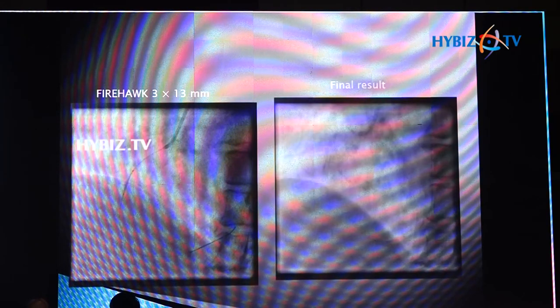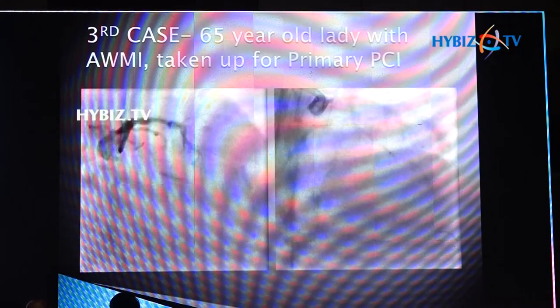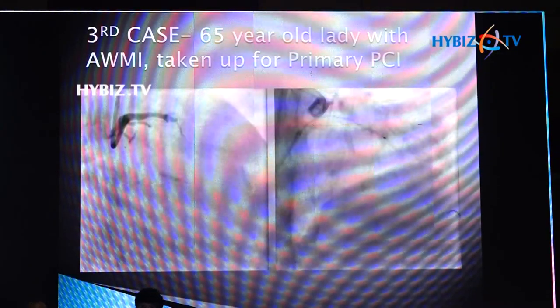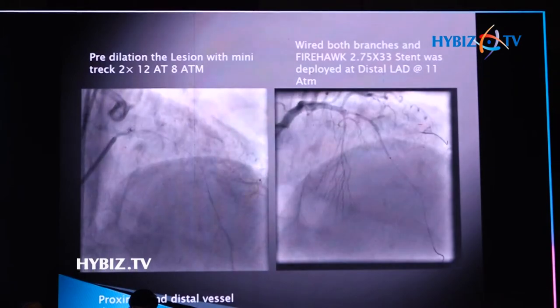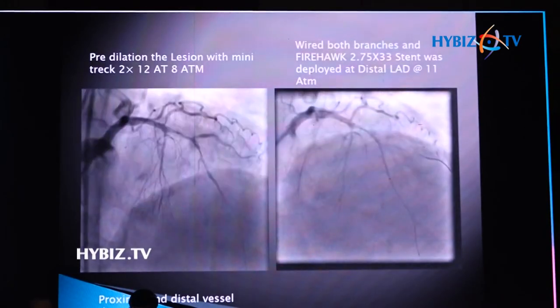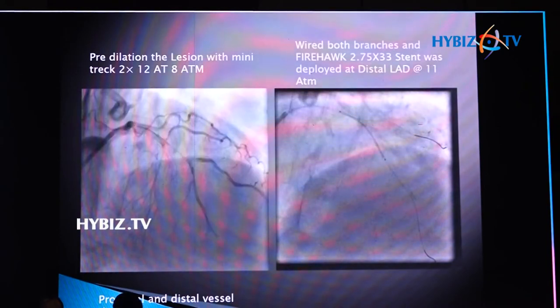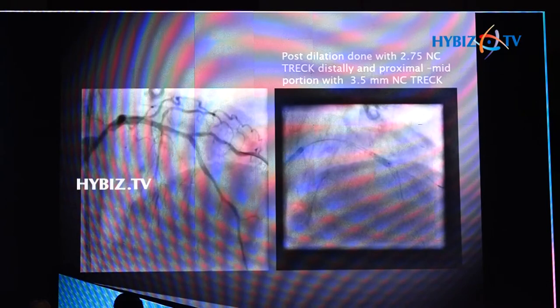The final result looked good and we were happy. This is a third case wherein a 65-year-old female presented with anterior wall MI. We used an XB 3.5 seven French guiding catheter and performed thrombus aspiration. We had a decent-sized diagonal. We did some pre-dilatation and there was significant mismatch — the mid and distal segments were involved. We used a 2.75x33 Firehawk stent after putting another wire to protect the diagonal. After deployment we had a decent distal landing zone and adequate dilatation, with some thrombotic lesion at the ostium of the diagonal.